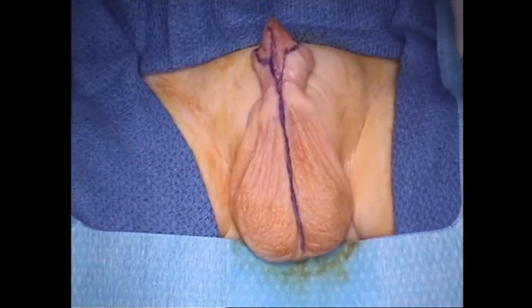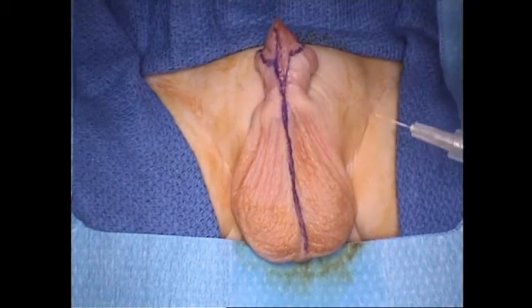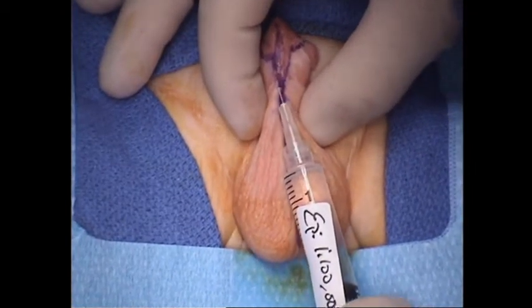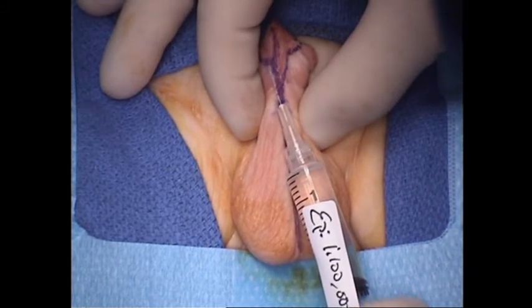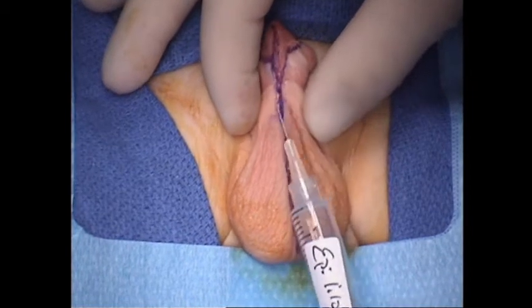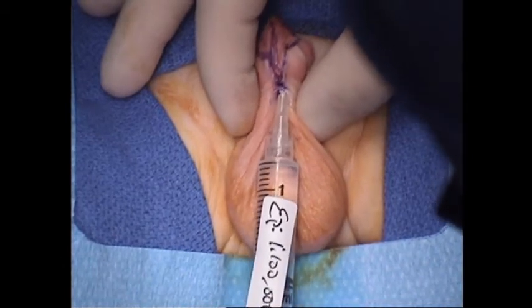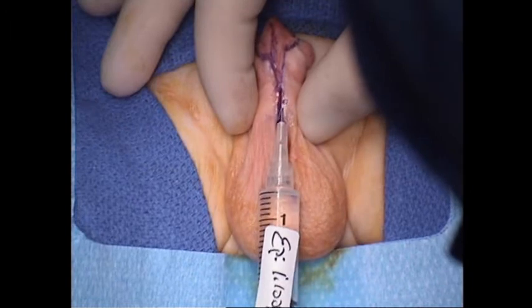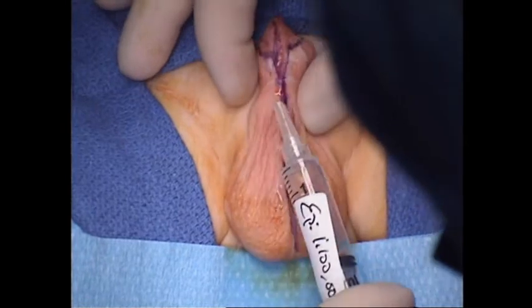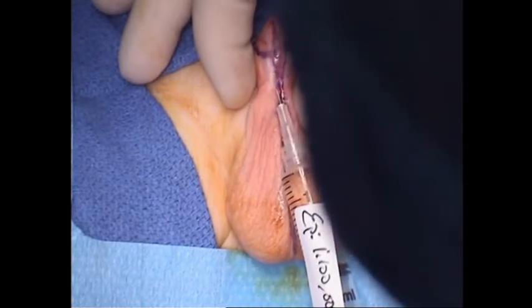Now in these cases of proximal hypospadias, at the beginning we want to go ahead and inject some dilute epinephrine. This is a 1 to 100,000 dilution of epinephrine. And we do that because oftentimes there's no spongiosal tissue in these patients, and so no dartos tissue. And so oftentimes the skin will be attached directly to the spongiosum. And it's very easy to get into the spongiosum with your initial skin incision or your initial dissection, and of course that can bleed. And so we want to try to separate the skin from the underlying spongiosum here, and using this as a hydrodissection will help with that.